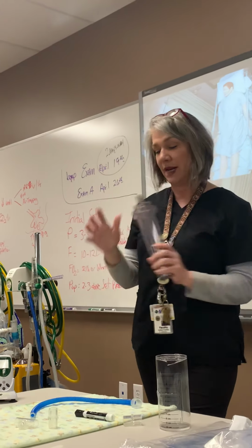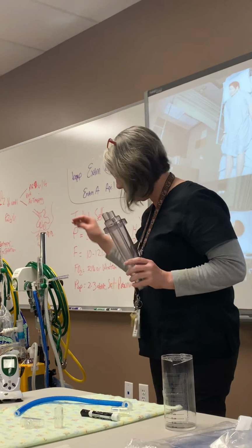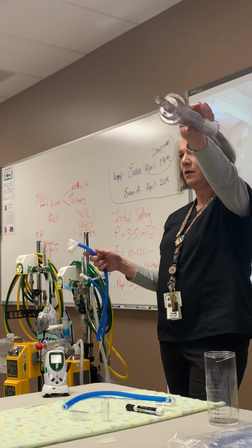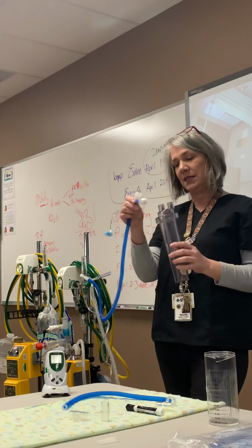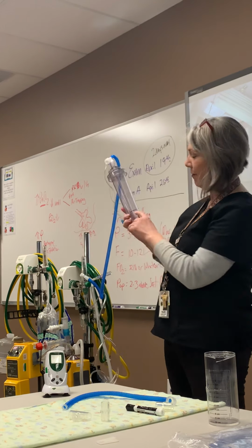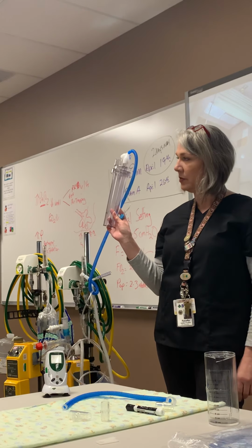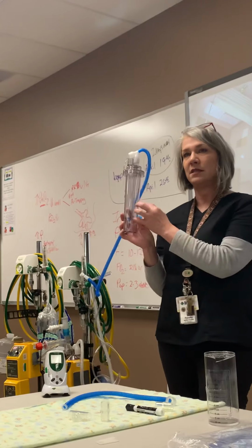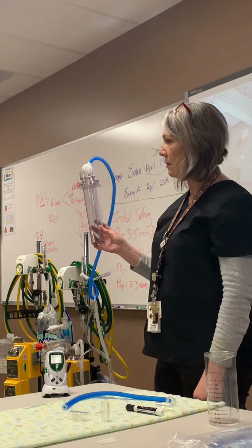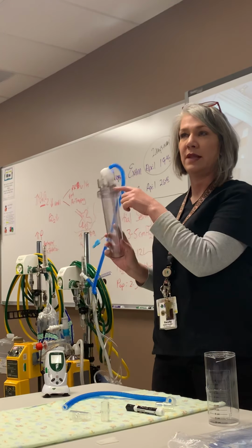Whereas with the Davis system, I don't need this additional piece or the 19 to adapt it. The piece of my circuit goes right on the top of my UC Davis where the tube is down in. It says inlet. And then I have 4 marked right here, I would fill to there for 4 centimeters of pressure. So that's the only difference. How do you adjust it for pressure? Now I add more. Oh, you add, okay. I add more fluid on this one right there in the top.